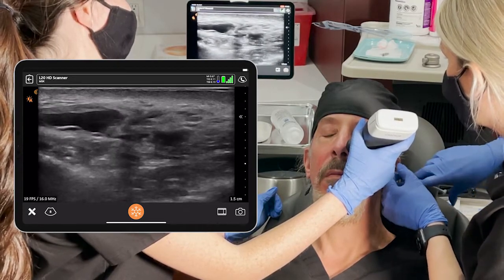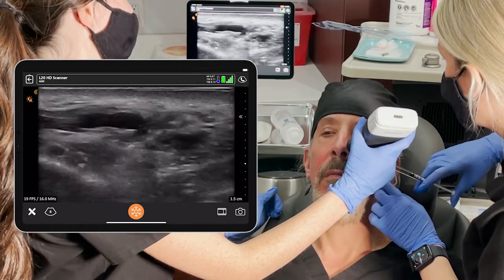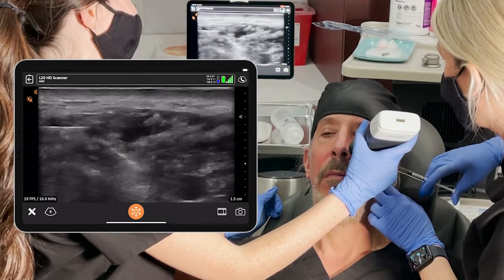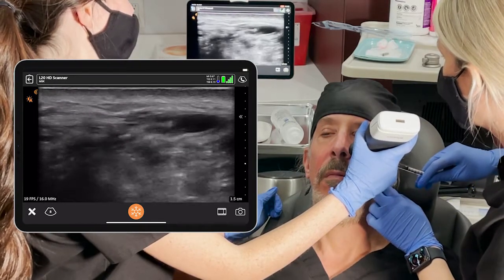You can see that we are actually within the pocket. You can see the cannula right here, and she's injecting as we speak. You see almost resolution of that nodule before our very eyes.